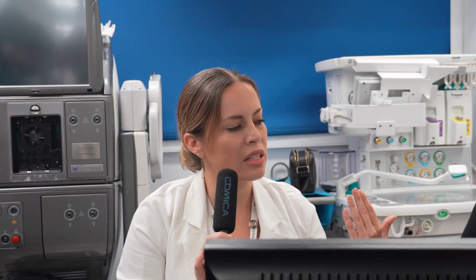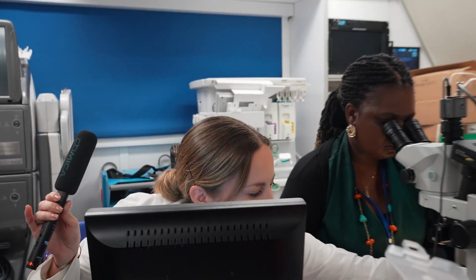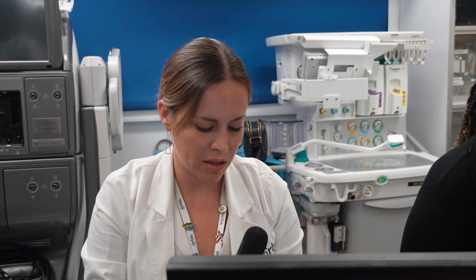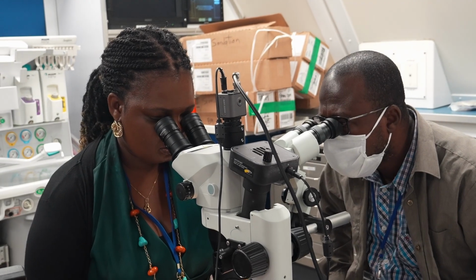So right now, everything that we're using is just like real life. All the instruments, all the knives that we are using, those are the real thing. Those are the ones that we use for a real surgery. The only thing that's different is these plastic eyes over here. These eyes have the exact same measurements as a real human eye. And then we're practicing how to take the cataract out. It looks like this, so it's very, very small. You take it out of the eye in one piece, and then you replace it with an intraocular lens, which is the step that the doctor is practicing right now.